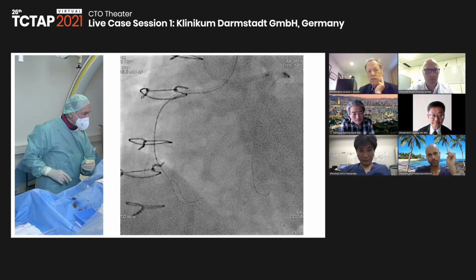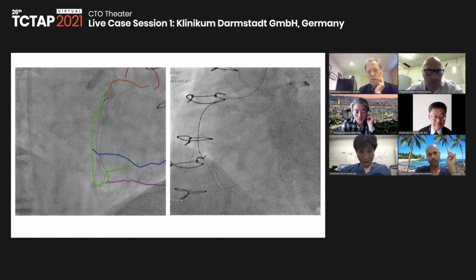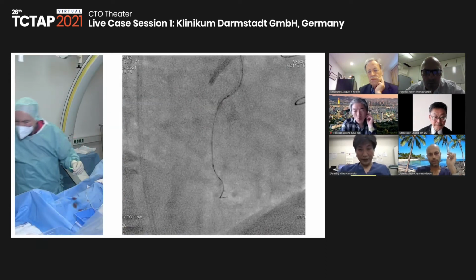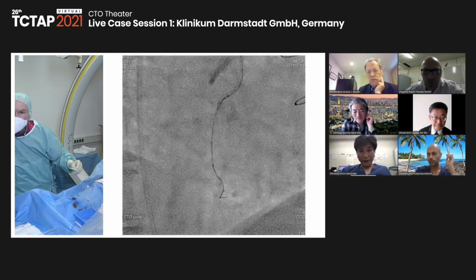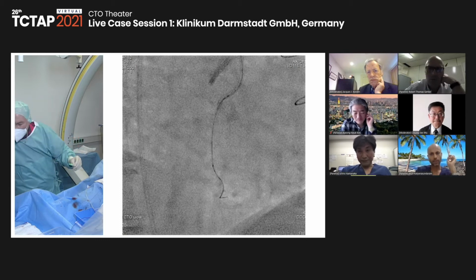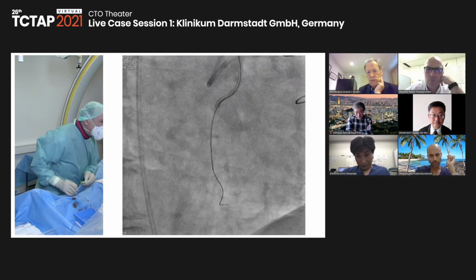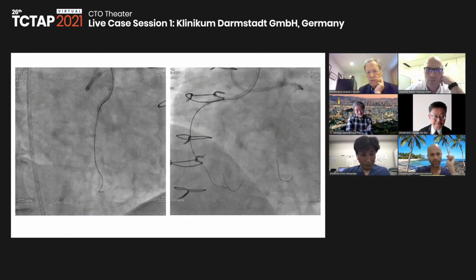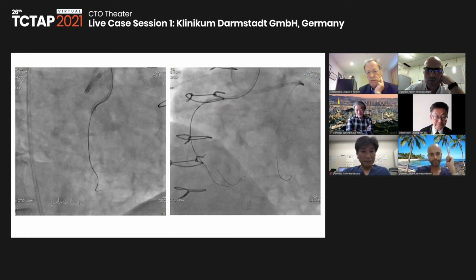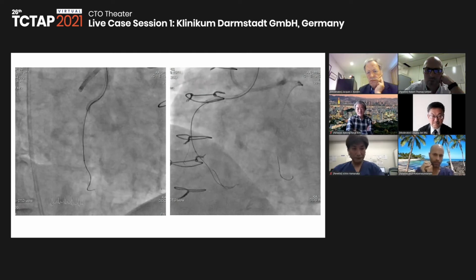Now let's see. Let's do the overlay. Would look like it's okay. Did you see the calcium on the angiogram? Yeah, I probably need to make a shot here to see it because we're maybe around the calcium. Looks like you're tracking it. It's very likely that we go subintimal there, but I will now make the contralateral shot and see how it looks.